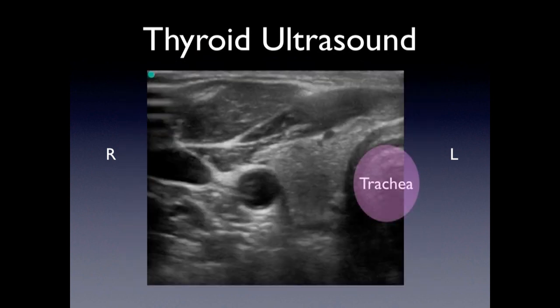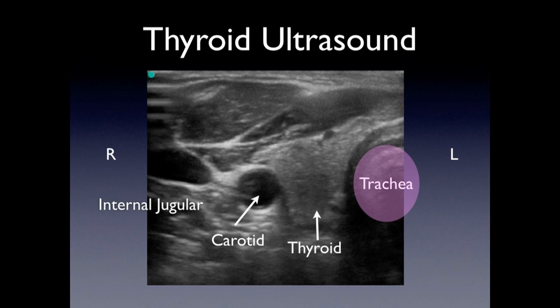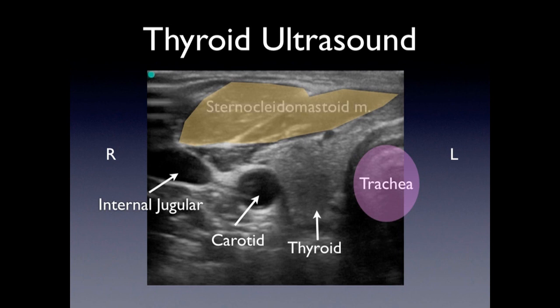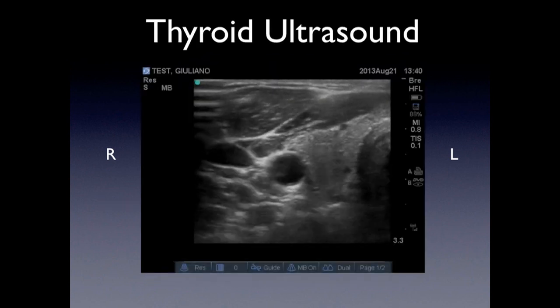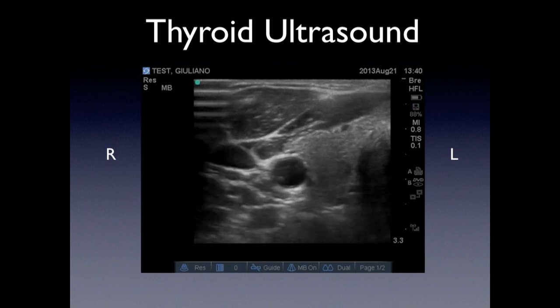Now let's move the probe laterally so we can see all the structures. In one image we should be able to visualize the trachea at the midline, and as we move laterally you'll see the right lobe of the thyroid along with the common carotid, then the internal jugular. In the most lateral and anterior portion of your image you're going to see the sternocleidomastoid muscle. Here's the moving image of the ultrasound — you can see the pulsations of the common carotid.